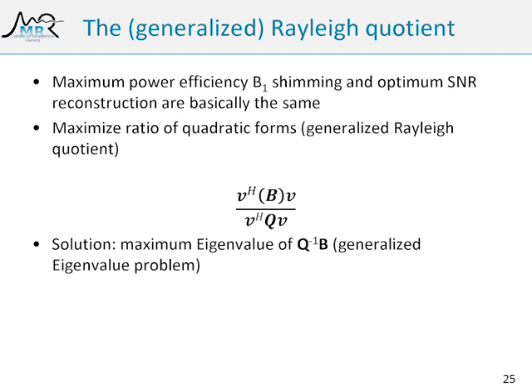And both those problems are basically the same thing, because you've got the amplitude of the B1 field. Let's say we have at one point, we can construct a vector B, and that contains just all the B1 field values that each coil has at that position.